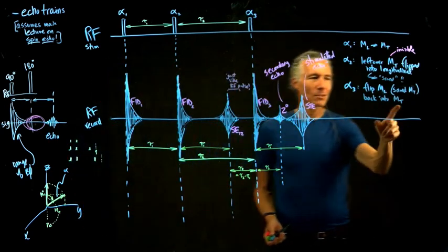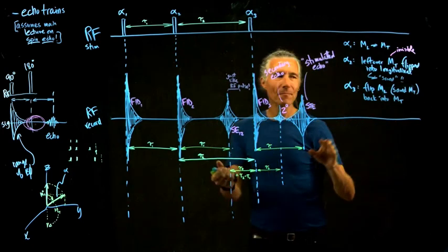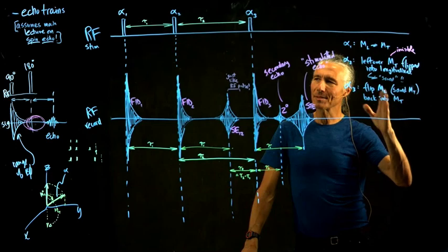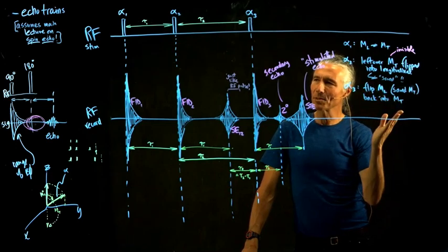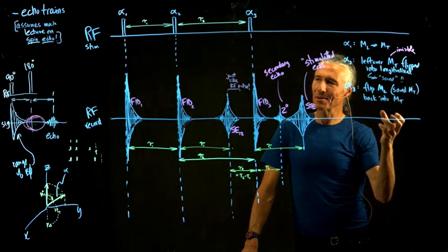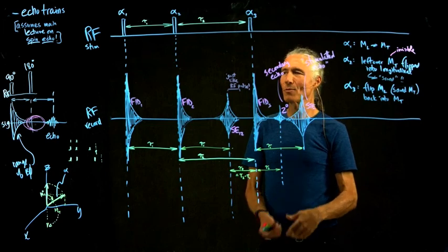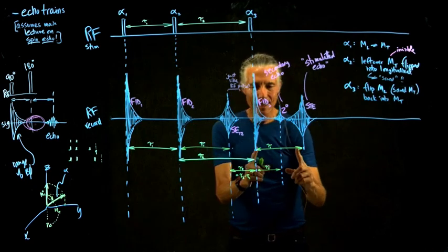And so it's like a SpinEcho, except that the thing that's weird about it is that what it's flipping around isn't actual transverse. It's just transverse that was saved as longitudinal. And then when we flip it, we suddenly expose it to the transverse axis, and then that will allow us to do the same kind of thing with SpinEcho, where whoever was behind is ahead, whoever was ahead is behind. And so that's why the timing.